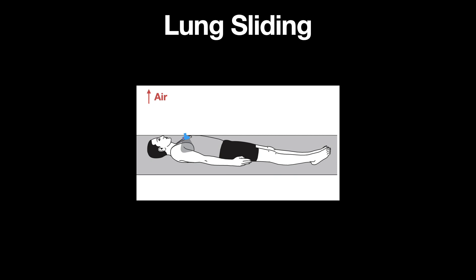To rule out a clinically significant pneumothorax, this exam is best performed with the patient completely flat, evaluating the most anterior aspect of the chest, usually the second intercostal space.